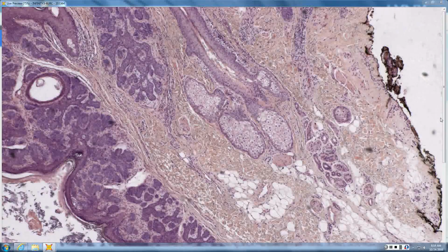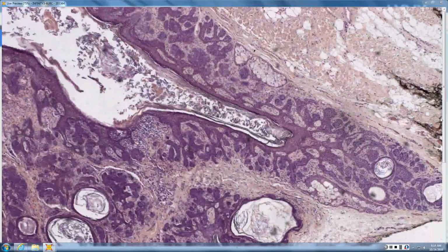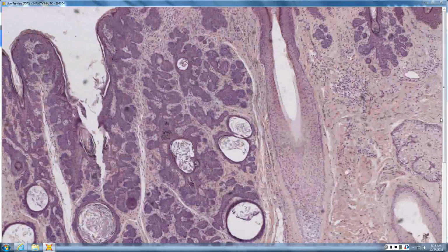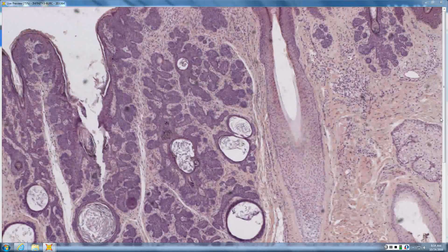That doesn't belong in this chapter, but since we're here, what is that? First, I thought maybe a basal cell. If it's a basal cell, it would be infundibulocystic BCC: pink strands, blue buds, horn cysts.